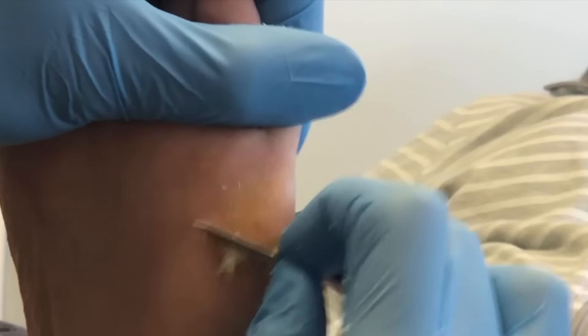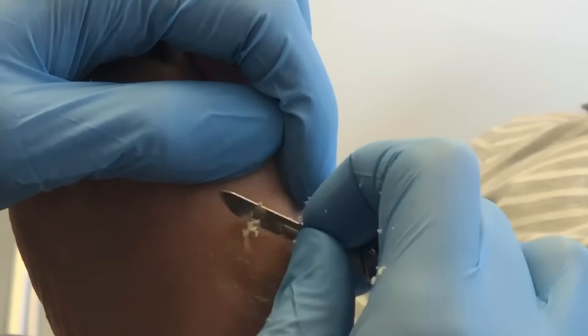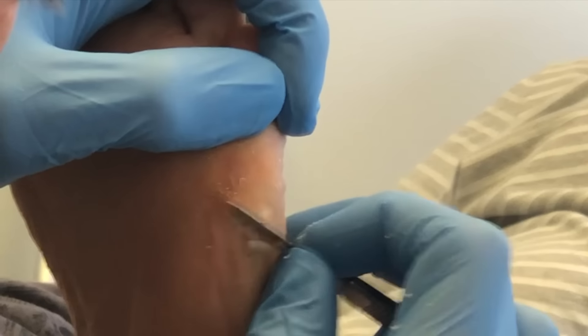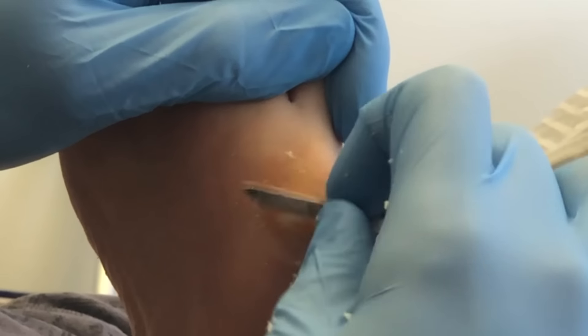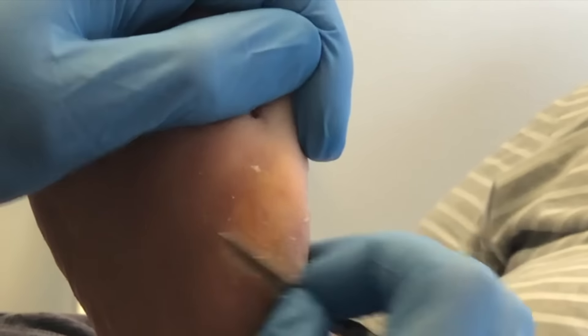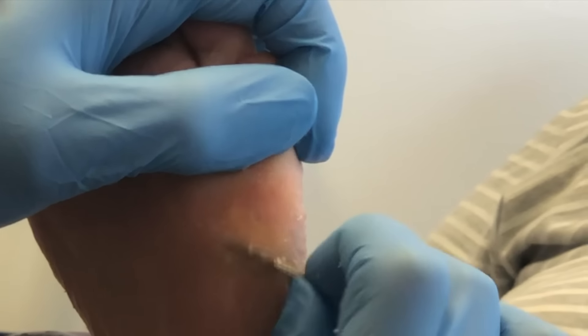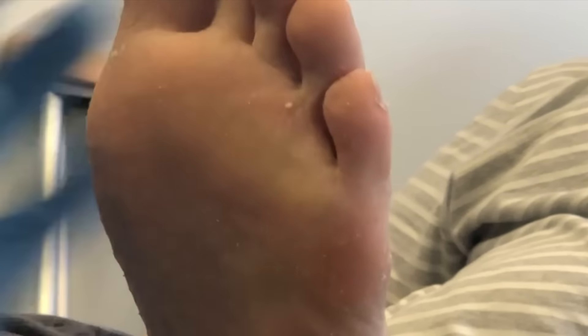On the left foot at the fifth MPJ — the metatarsophalangeal joint — on the bottom, there is what we call a heloma durum, or a corn. You can kind of see it there in the middle. I'm working on the outside to make sure it's nice and flush with the skin, and then right in the middle is the corn. Again, you'll notice the skin tension — something you always want to maintain so that you don't cut the patient.